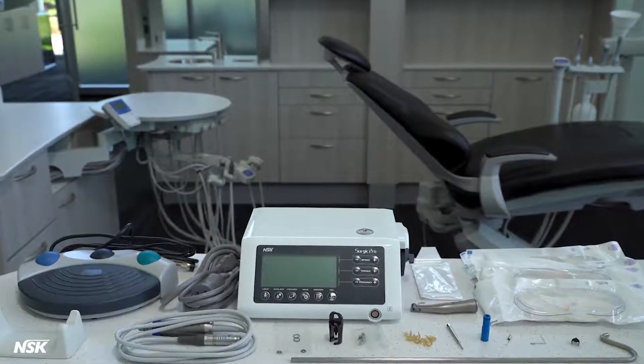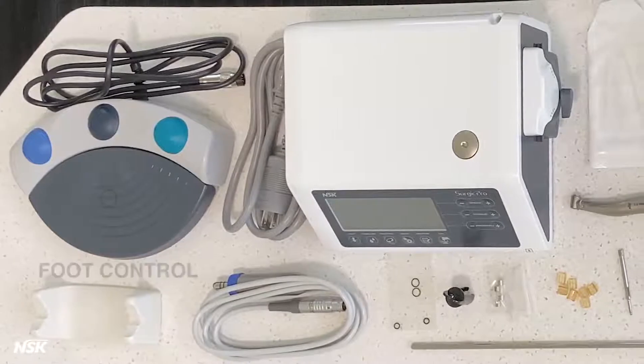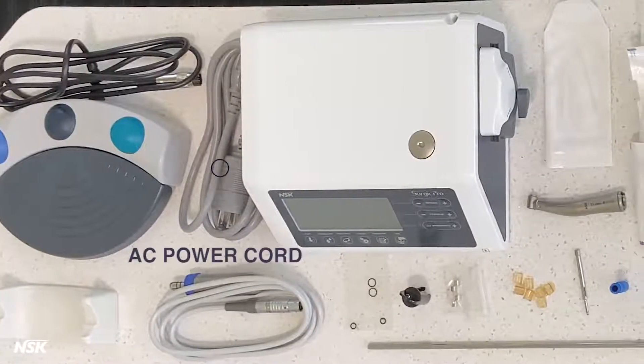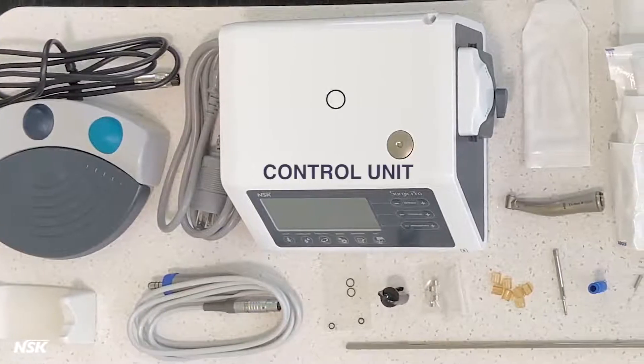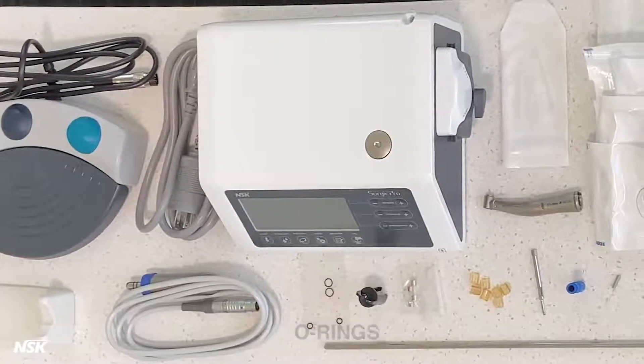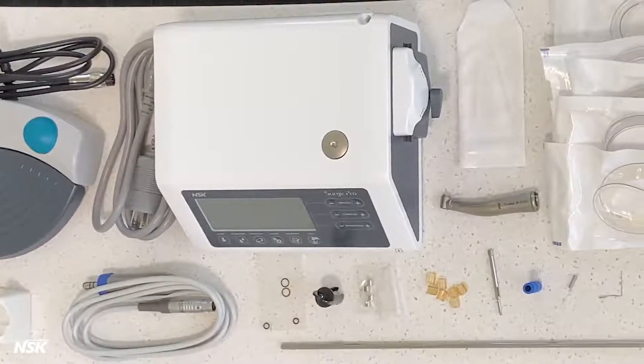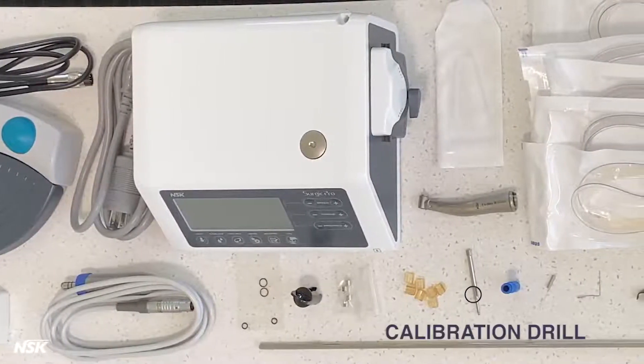Here's what you'll find inside the box: handpiece stand, foot control with cord, micromotor with cord, AC power cord, control unit, O-rings, protection plug for motor, spare fuses, tube holders, and calibration drill.